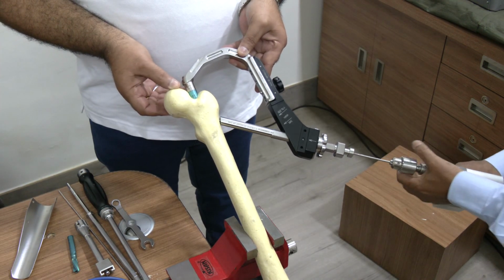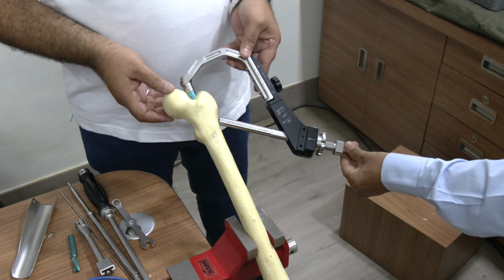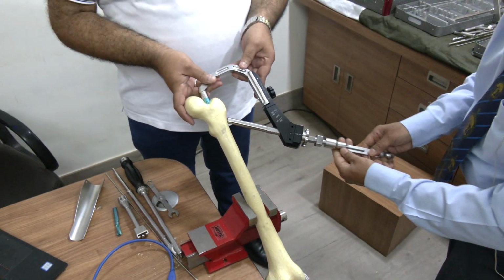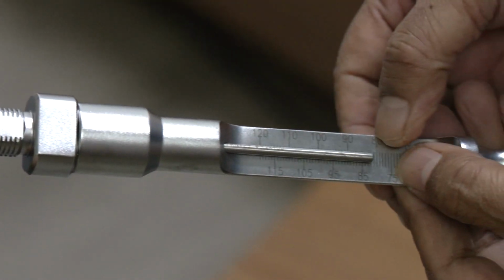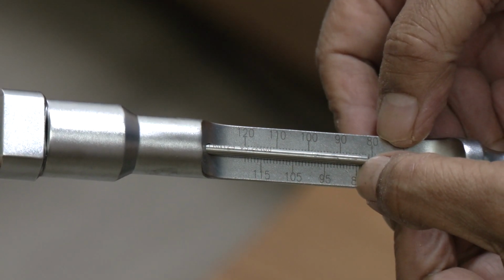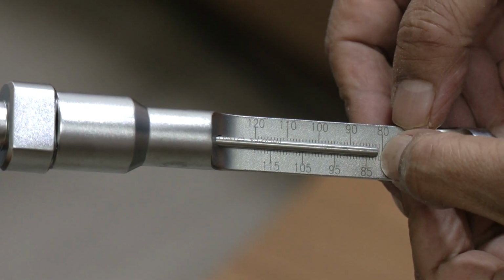Okay, I have passed the guide wire adequately now. The next instrument is to measure the amount of guide wire which is outside. You can directly pass this instrument onto the guide wire and take a measurement. It is between 80 and 85. It is a little shorter than 85 but more than 80.